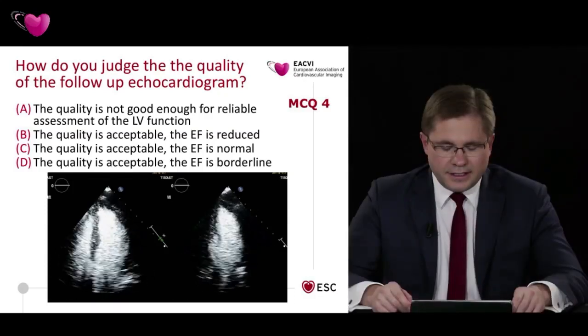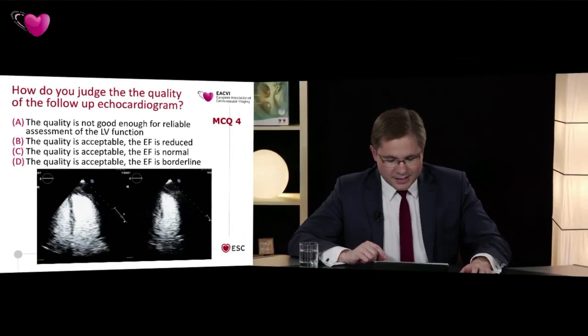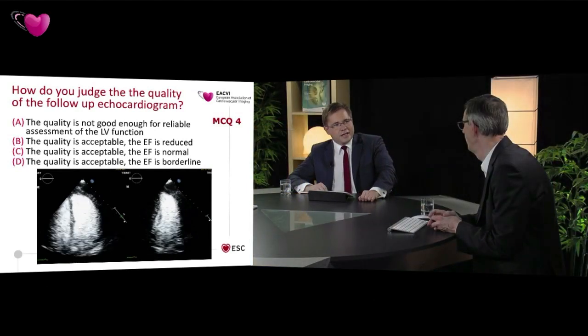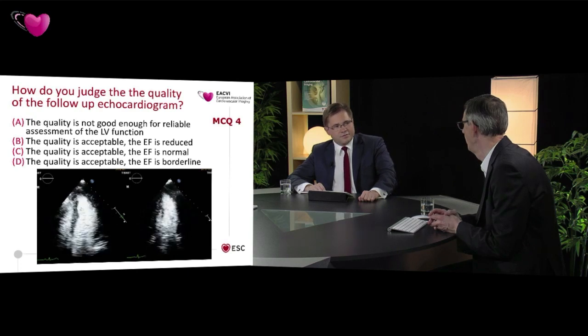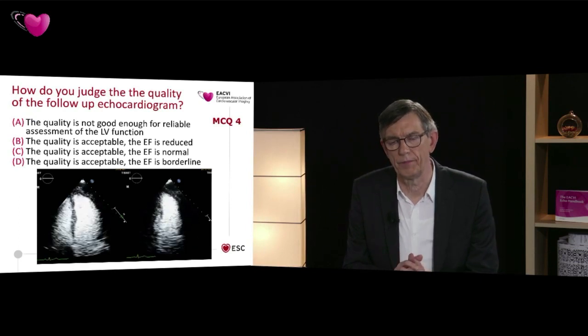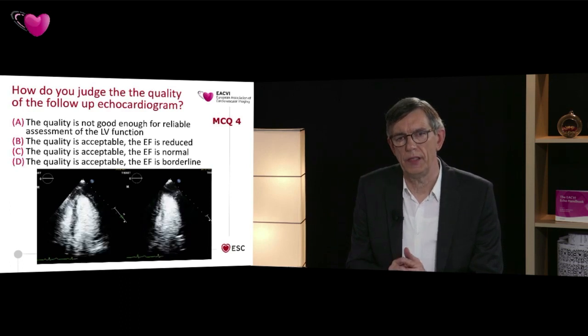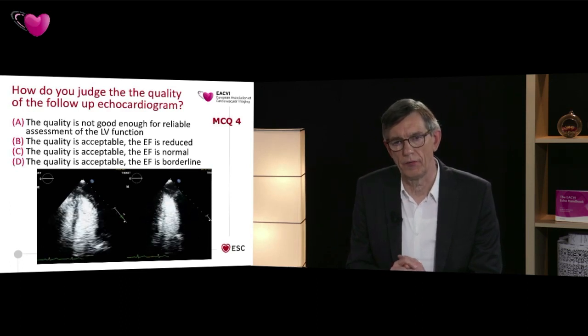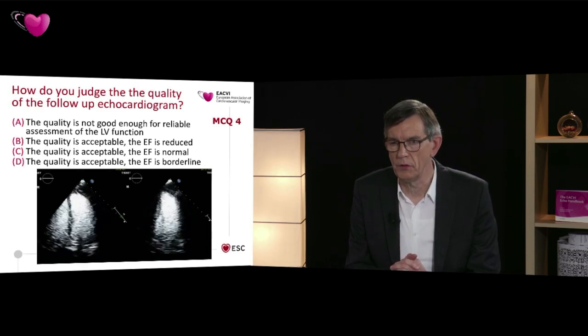Please vote. During voting, I would like to use this time to ask you one of the questions that has just arrived: is echocardiographic screening necessary for every chemotherapeutic used? No, that's a very good question. The EACVI has provided a list of cardiotoxic cancer drugs and highlighted those where we have to do screening.